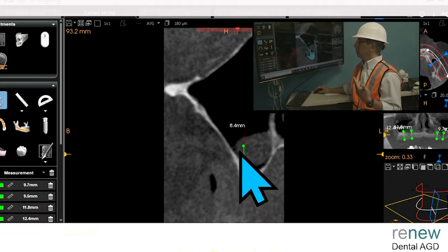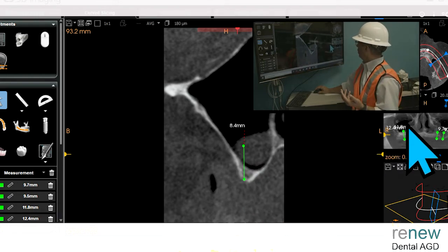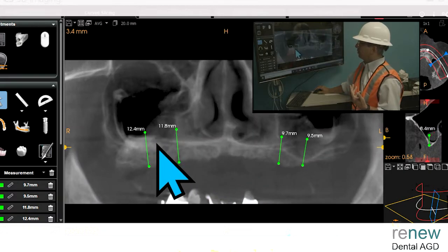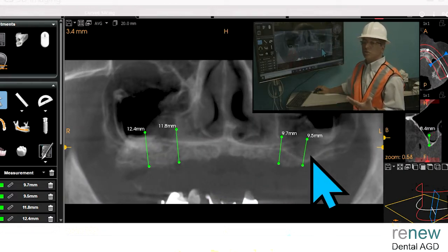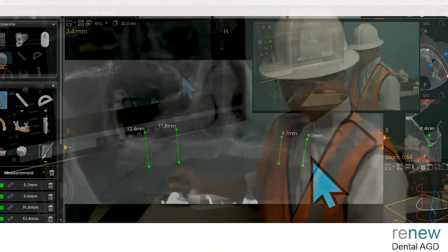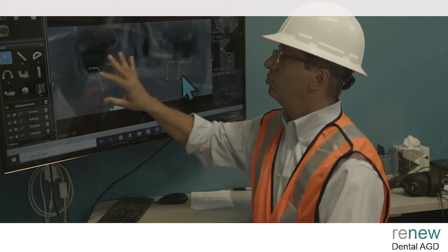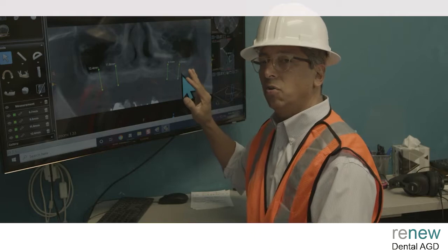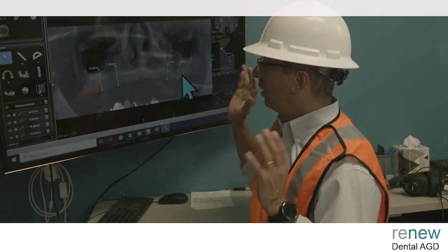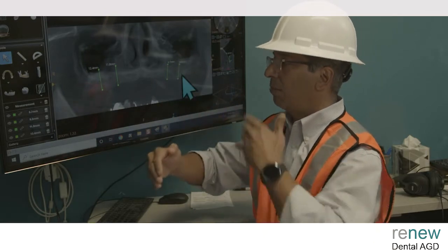This looks a little bit better in the healing. You've got a nice little area to do your lateral window, but you are getting further back out here. It becomes a little bit more challenging surgically. So this case really takes it to a new level, that if you are not a skilled surgeon, you are dealing with a very, very difficult, hard kind of case, stepwise.